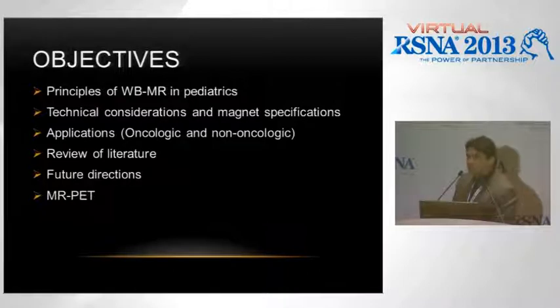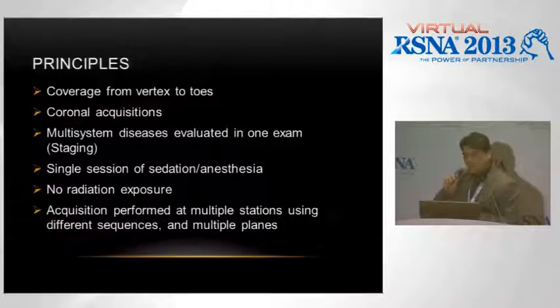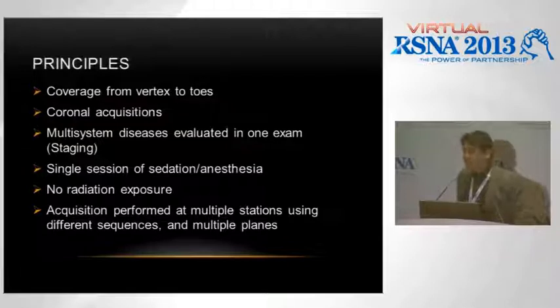And I will show you a few case examples of MR PET, since we were fortunate to acquire one a few months ago. Although it's a very brief experience yet, since it's only 6 months old. So clearly, in terms of coverage, whole body imaging, you're covering from the vertex to the toes.